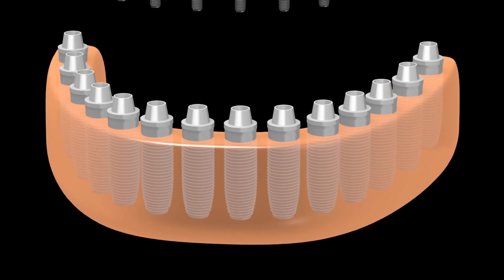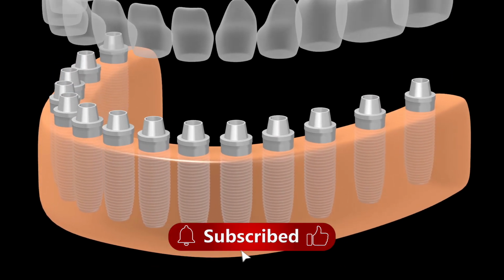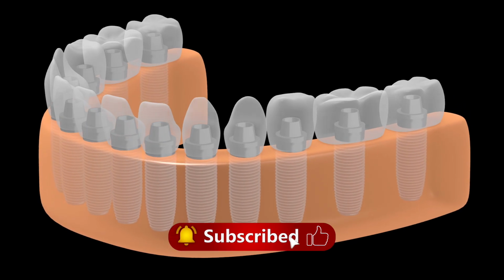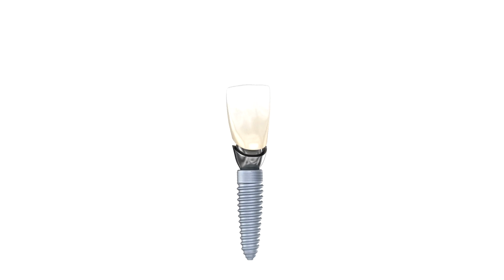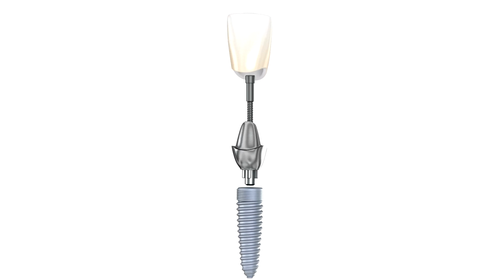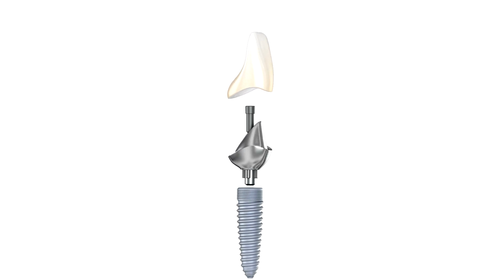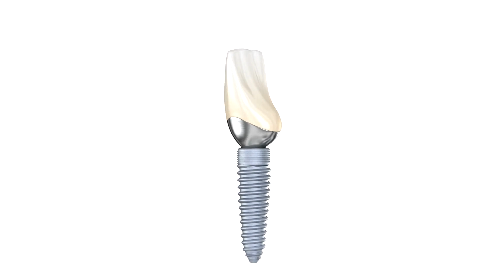2. Macro design: body shape and thread geometry. Next, let's examine the macro design, the overall geometry. The two primary body shapes are parallel-walled and tapered, or conical. Parallel-walled implants were the standard for many years, relying on precise bone preparation. Tapered implants, however, mimic the shape of a natural tooth root.